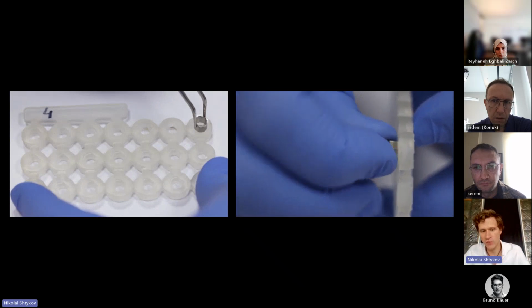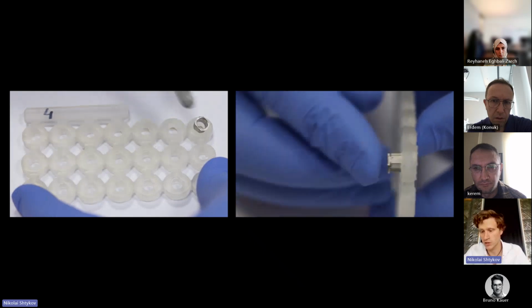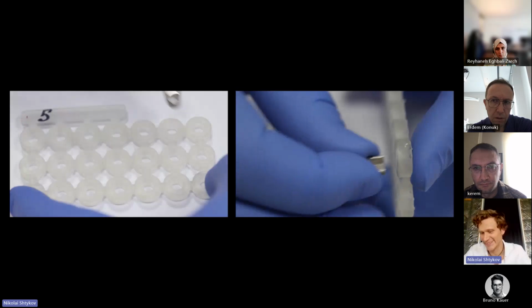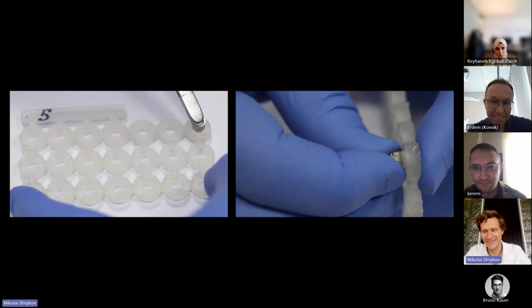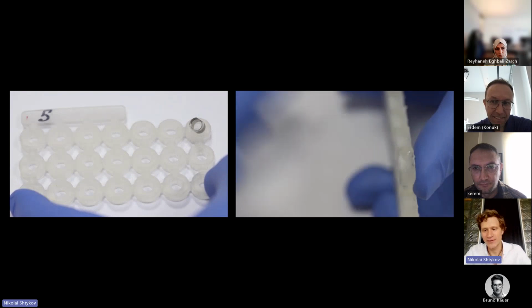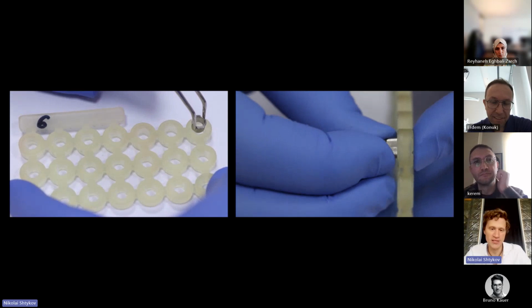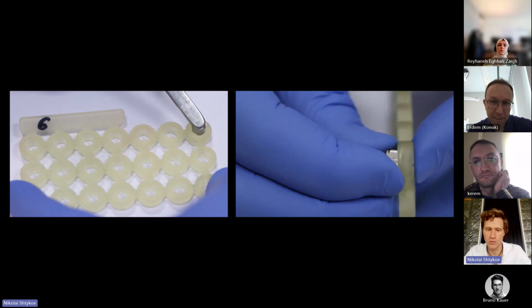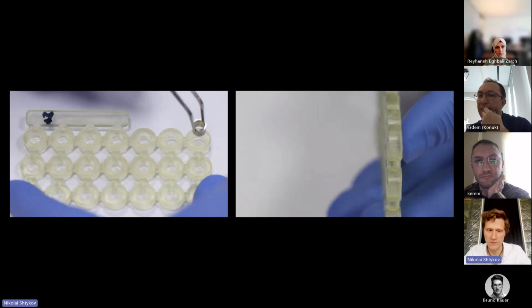And you can see only the first surgical guide was printed on a good quality printer. That was, of course, RapidShape. And there we have good offset. This experiment has 8 types of guides, and only 3 guides have good fixation of the sleeve.